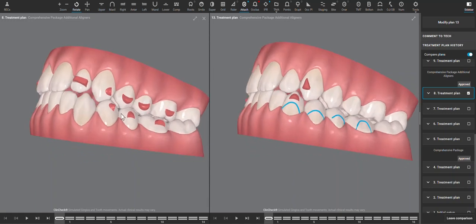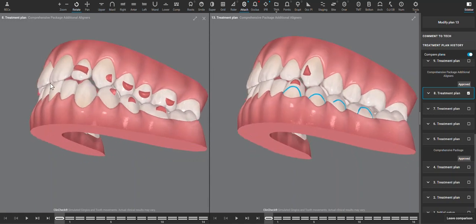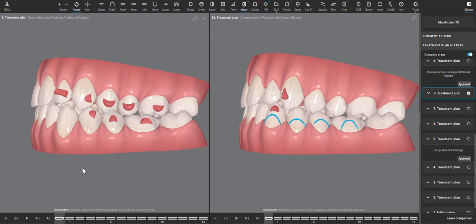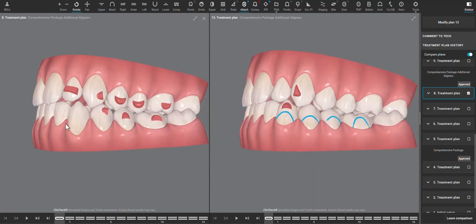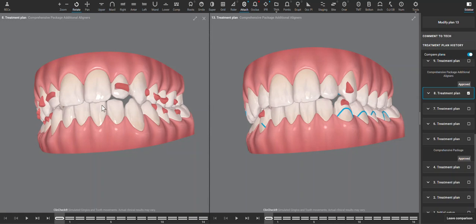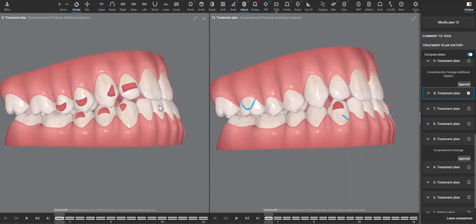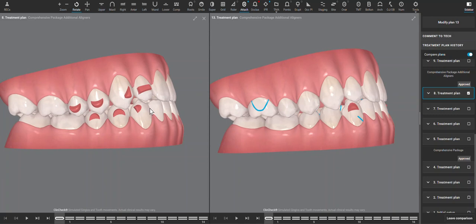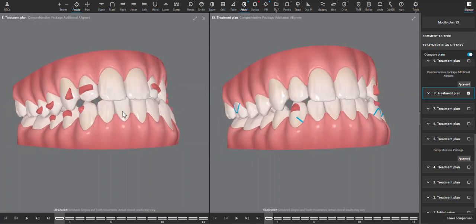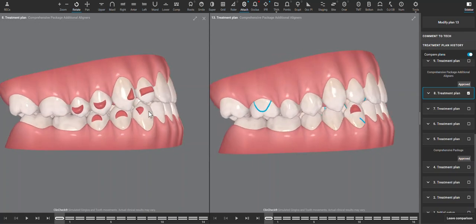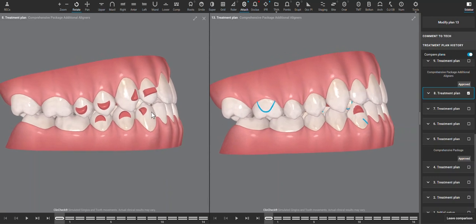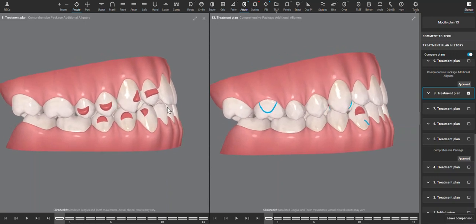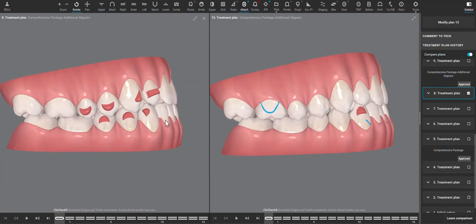But more so, what we're seeing presented now I think is a function of an anterior interference. Because there were so many other types of movements being planned on the initial ClinCheck, there wasn't much control over the lower anterior intrusion. You can see that these teeth are still in a higher plane than the posterior teeth, and the AP movement just flat out didn't happen as well. These anterior teeth are still stuck with each other.